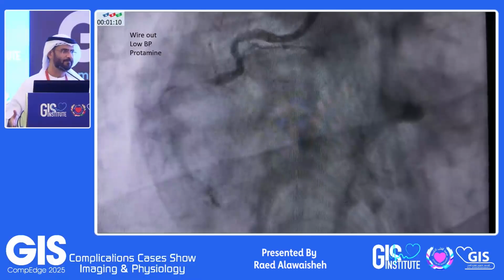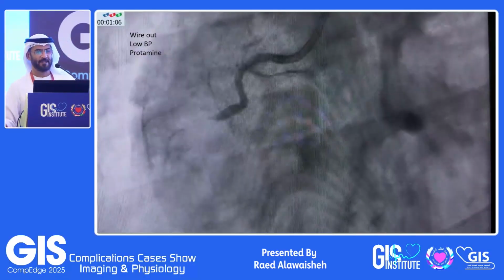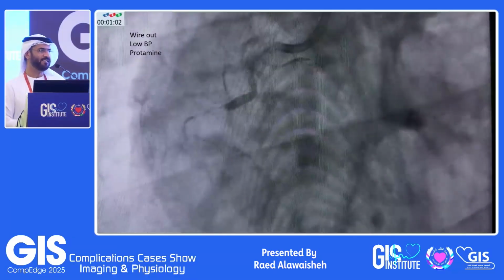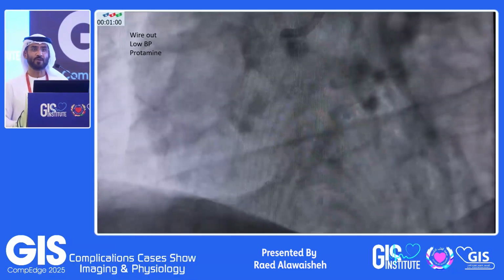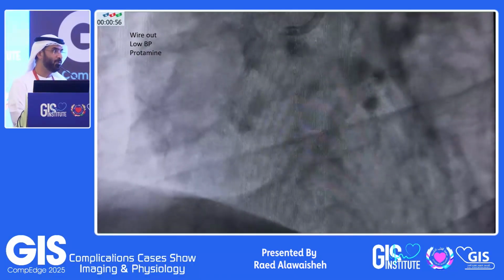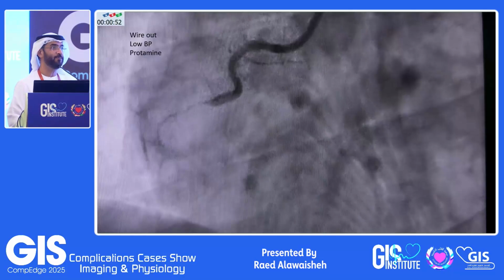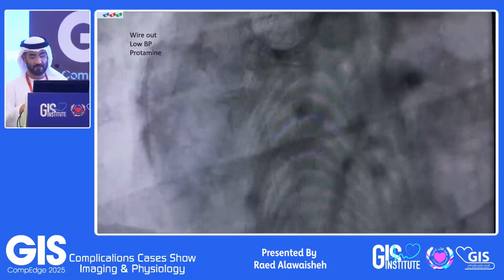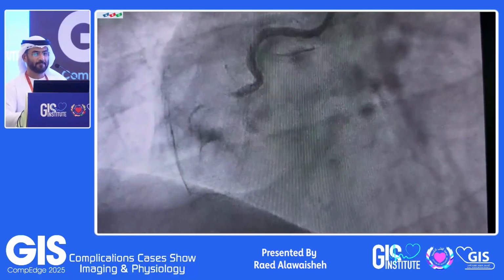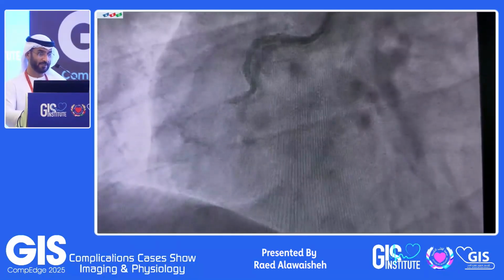He got fed up, the operator. He took a long time. Then he wanted to see how bad it was. So at this time, why is protamine given at this time? Because you don't want to give protamine when items are inside the coronary. If the wires or balloon are inside the coronaries, don't give protamine. The coronary might thrombose. So he felt things were getting worse and worse and worse.